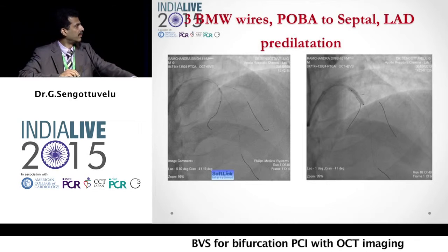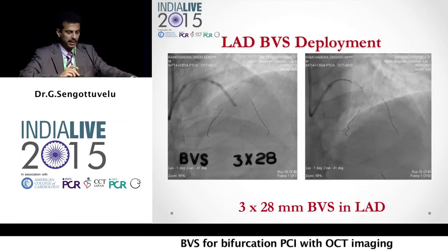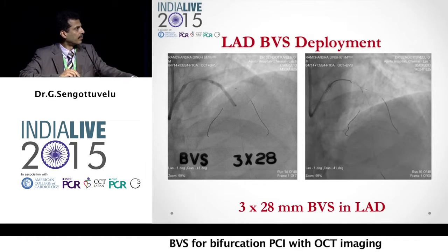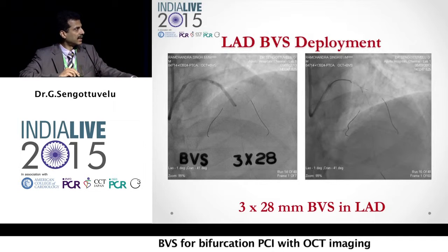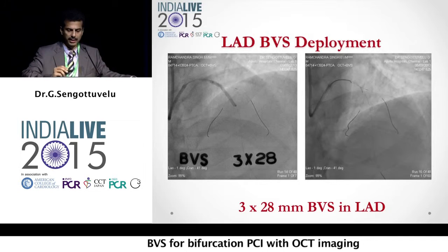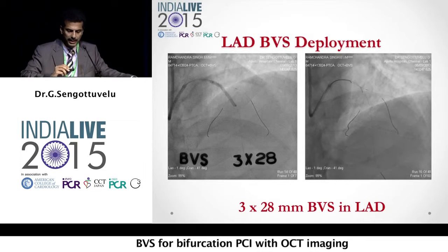After predilating the diagonal LAD, we took in a 3.0 to 28-millimeter absorb scaffold and deployed it. As you could see, the diagonal flow closed — and this is quite a significant, big diagonal.